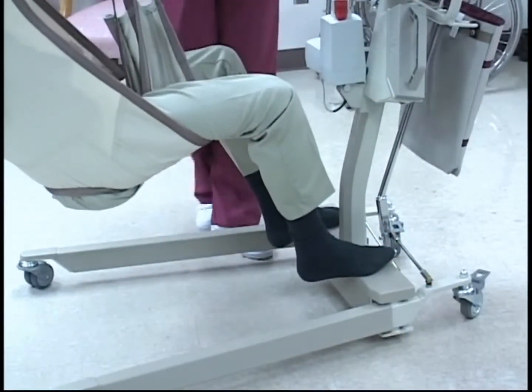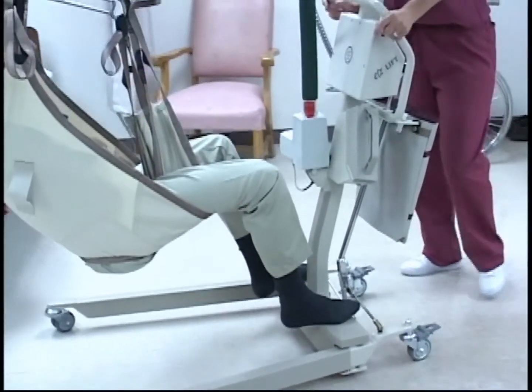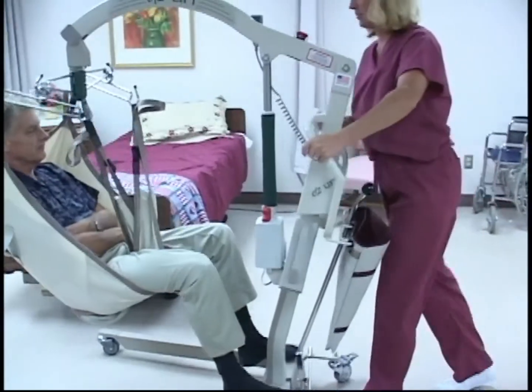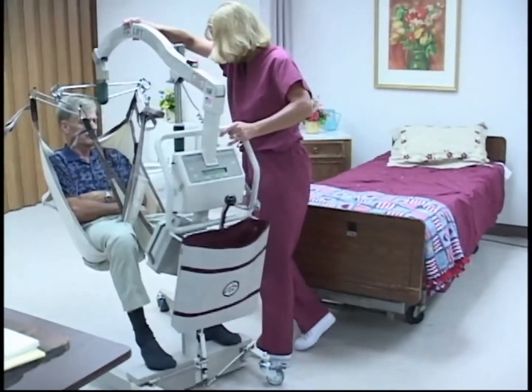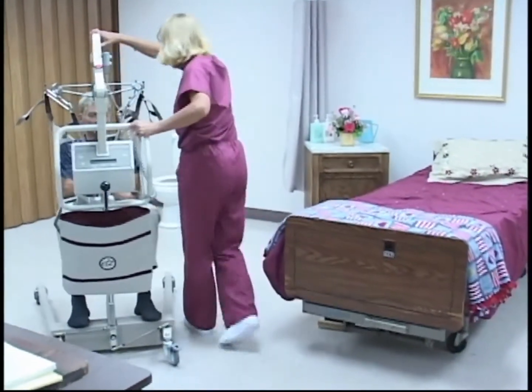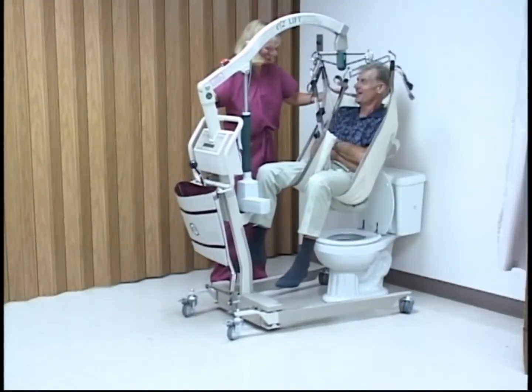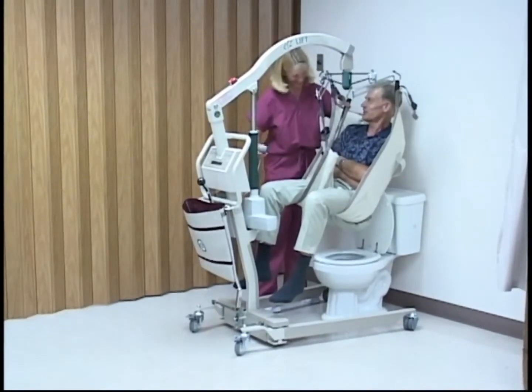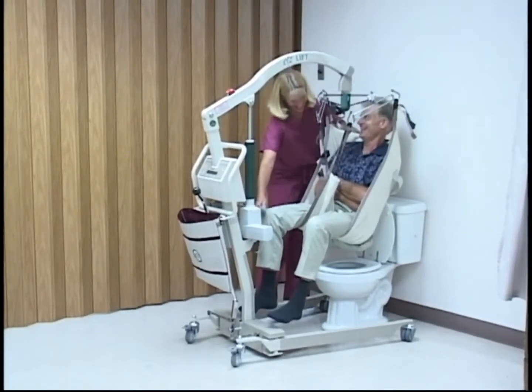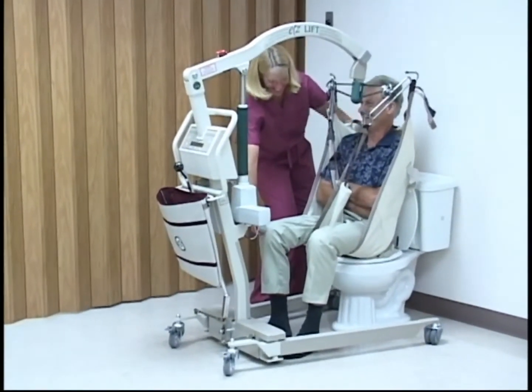When using the EZ lift for transferring patients, lower the patients so that their feet are resting on the base. This will make the lift control and turn more easily and give the patient a greater feeling of security. EZ-Way slings are designed for easy toileting. After the patient has been transported to the bathroom, position the lift around the toilet and lower the patient.